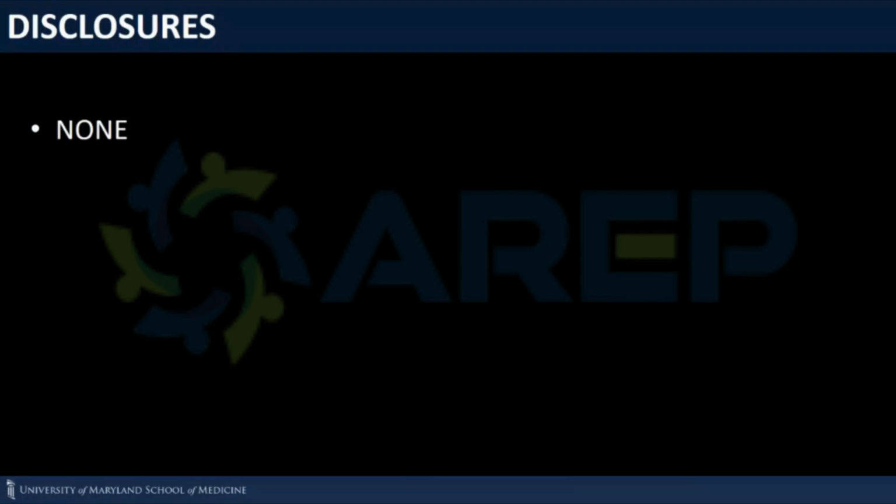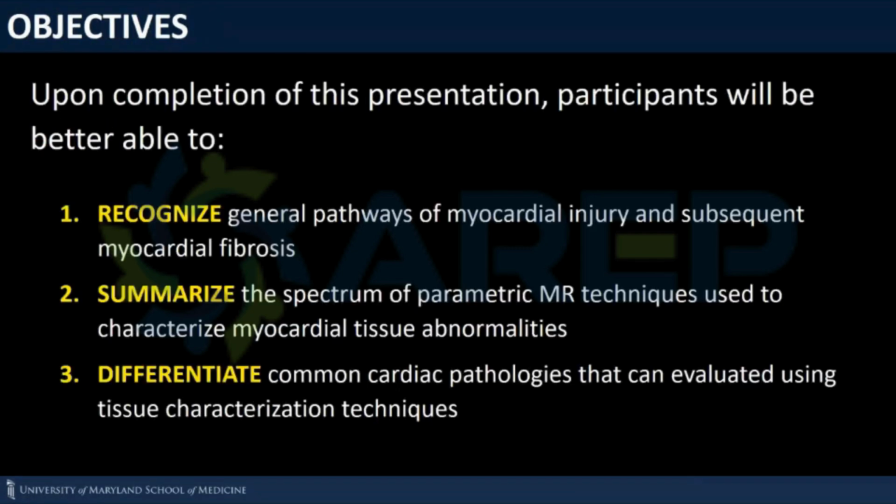When we talk about the main objectives for this talk, it will be to, one, recognize some of the pathways of myocardial injury and development of myocardial fibrosis. We are going to summarize some of the parametric MRI techniques that have been developed and that we can use to characterize myocardial tissue abnormalities. And then we want to see how we can differentiate different cardiac pathologies that can be evaluated using the tissue characterization techniques of MRI.